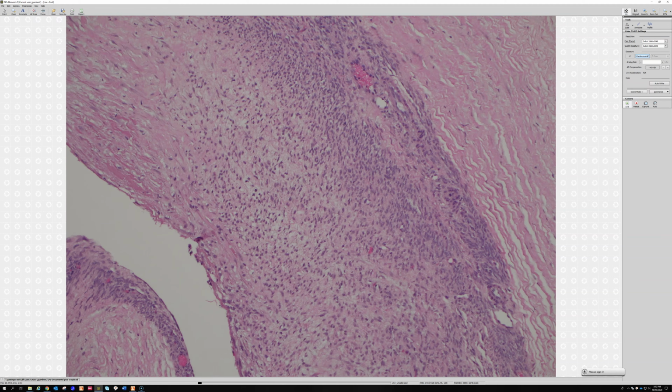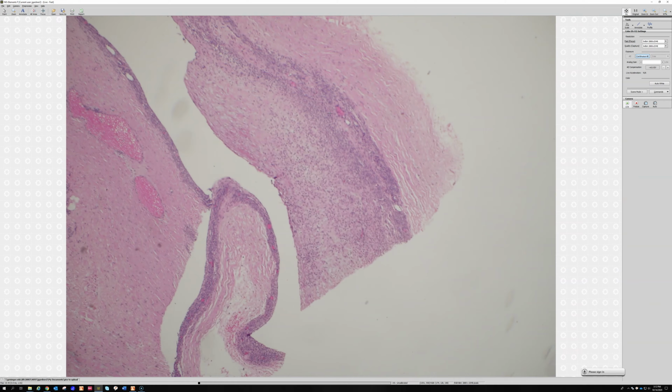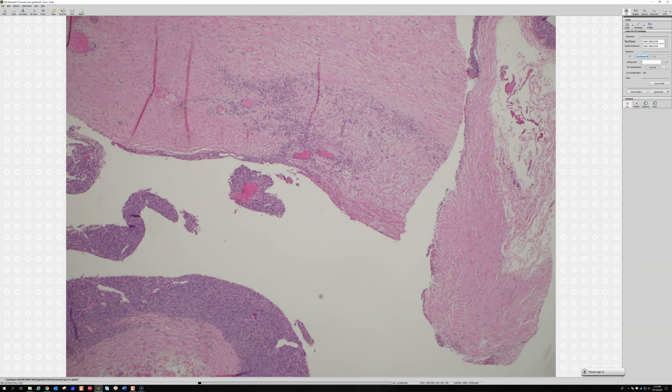And here's an example. Look at how hypocellular. If you just had a picture of this, man, I wouldn't think of synovial sarcoma. I don't know what to think of it. It's hard to imagine now, but you'd wonder about a lot of other stuff. Looks pretty benign right there, but this is actually still part of the tumor. So yeah, SS18, SSX you can test for with FISH or RT-PCR. I usually like to do the break apart.